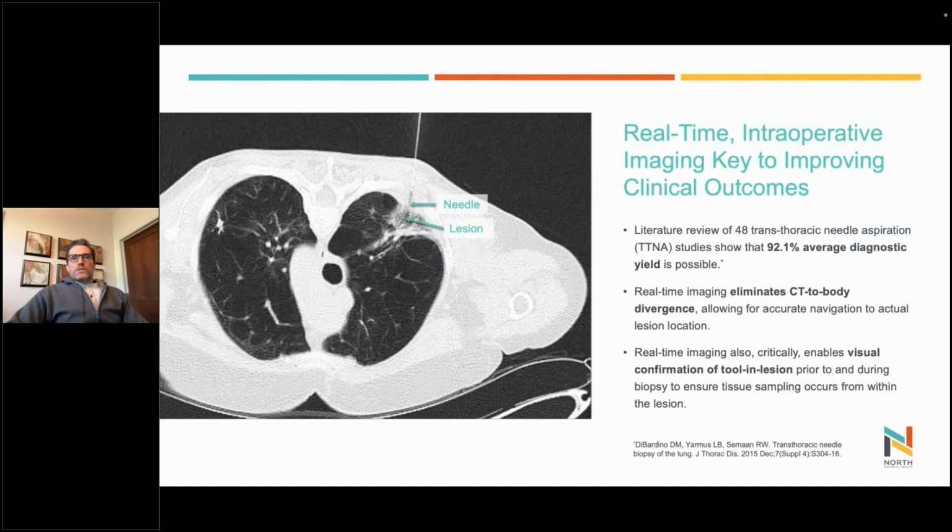And why that's really important is, we are always trying to compare ourselves to CT guided biopsies. We want to say that we can be as good. We know that we can have fewer complications. We know that we can also do a lot more during the bronchoscopy, whether or not it is cancer, including nodal staging, including looking for other reasons that the nodule could be there if it's not cancer, like doing our BALs and all of that. We all know that the guidelines say that we should be doing the least number of procedures possible, but for this time, we also know that when we miss, we rely on our radiologist to actually get there.